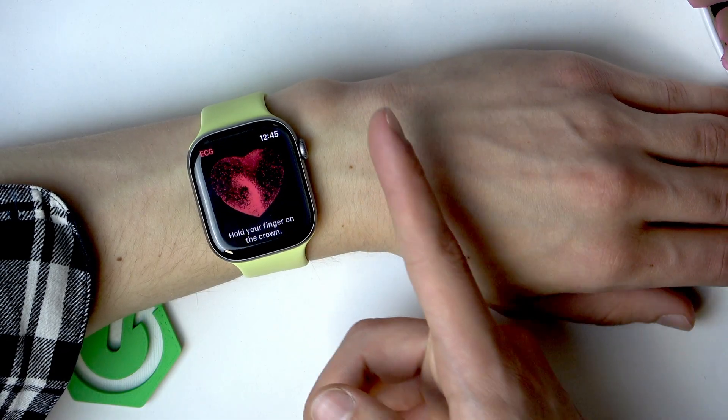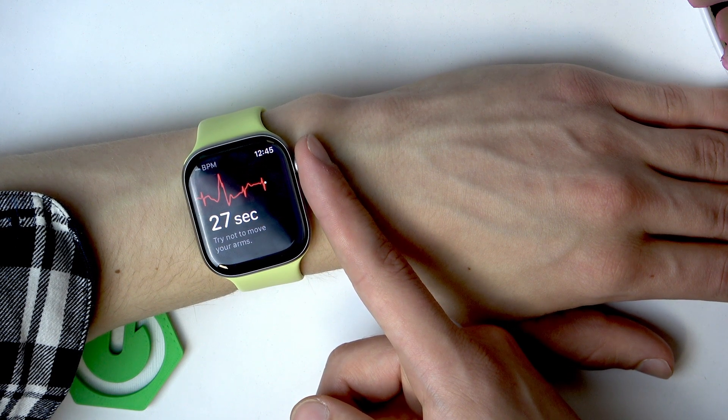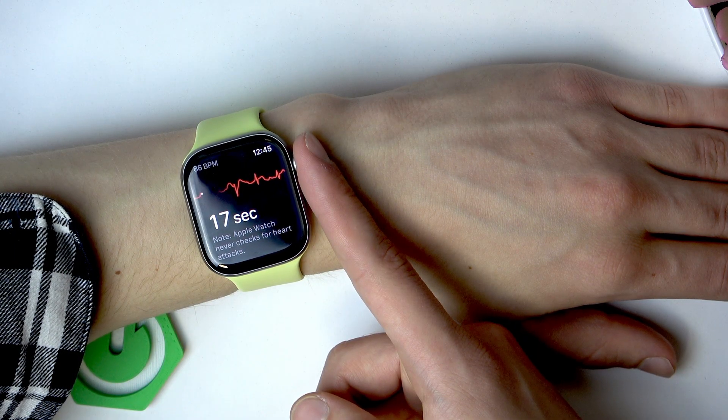Then hold your finger on the crown like this and wait for the measurement to be taken. Try not to move your arms too. The measurement will take around 30 seconds.